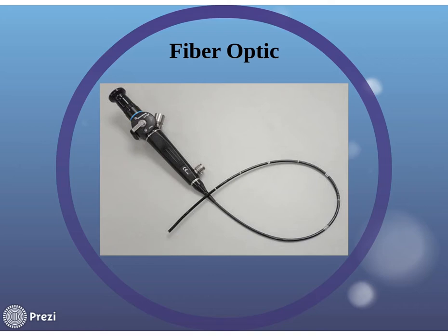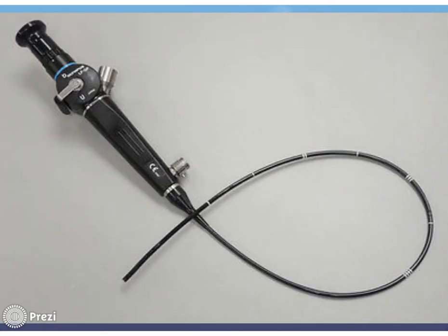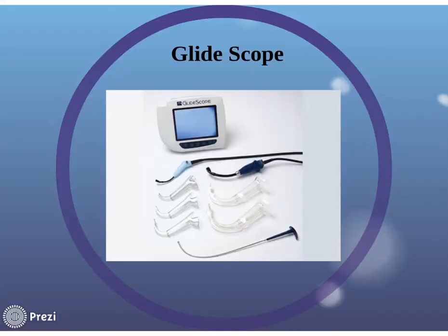They have adult sizes and pediatric sizes for those. And the famous GlideScope. Now, there's lots of different versions of these. These are the ones that have the plastic handles that fit right on the end of this. This is the pediatric one. This is the adult one. And these just fit right on there. But they also make a GlideScope where you have to take them off and wash them.